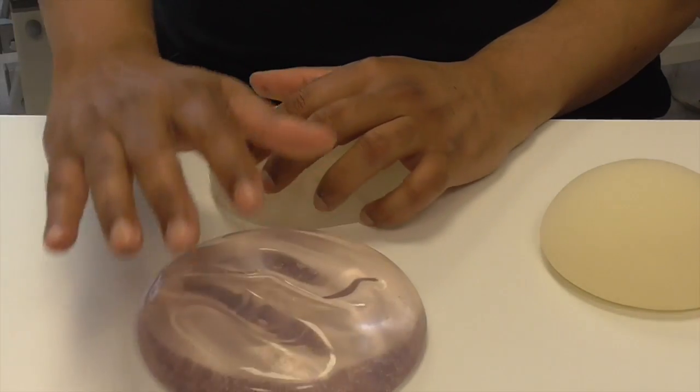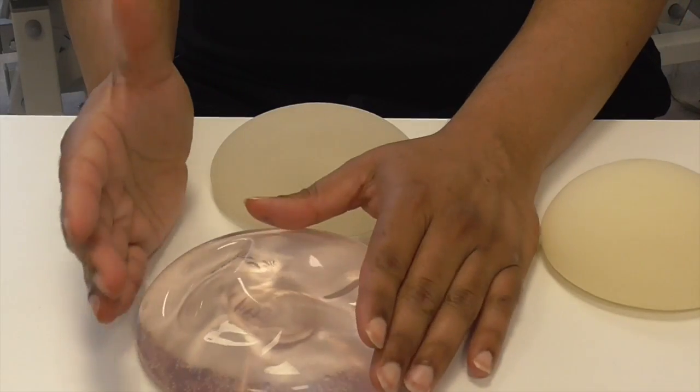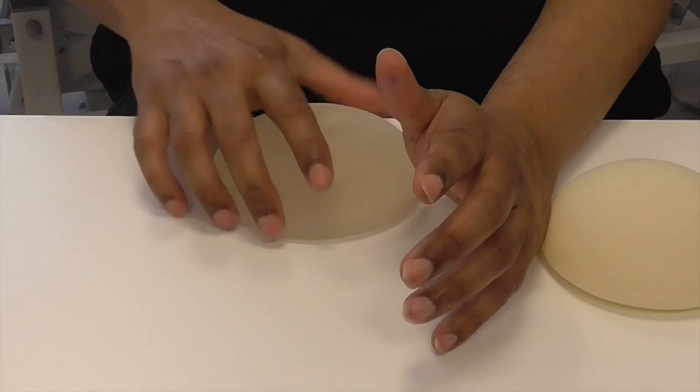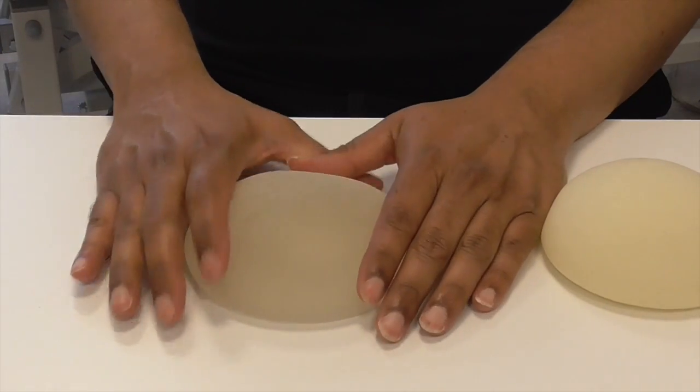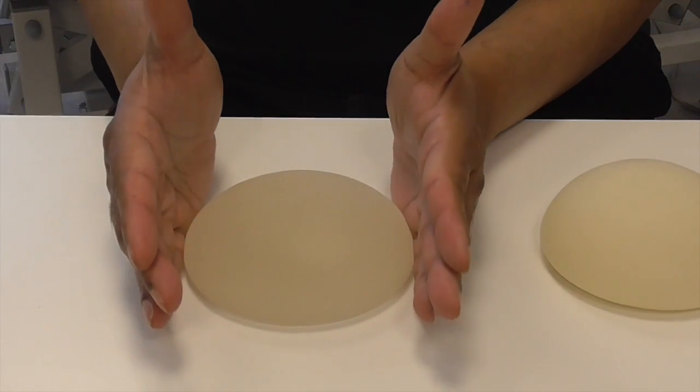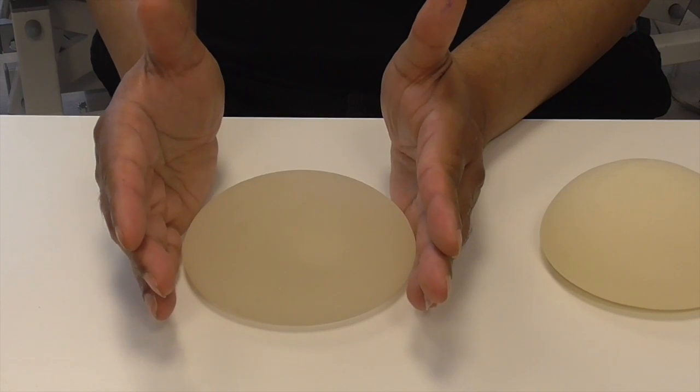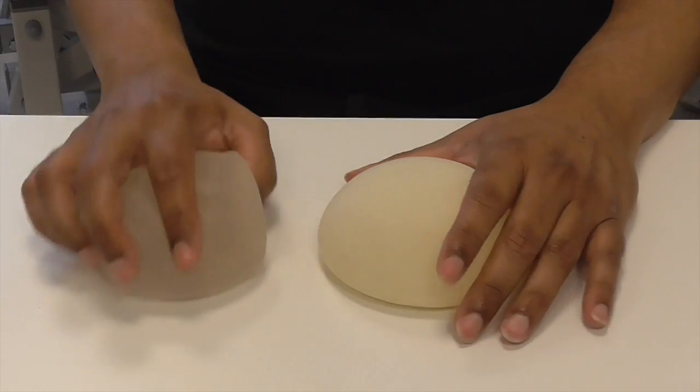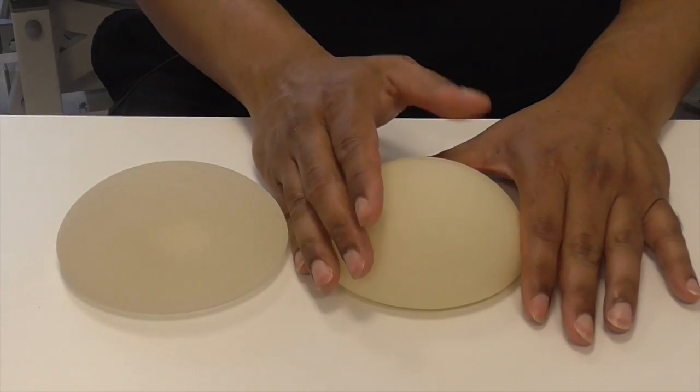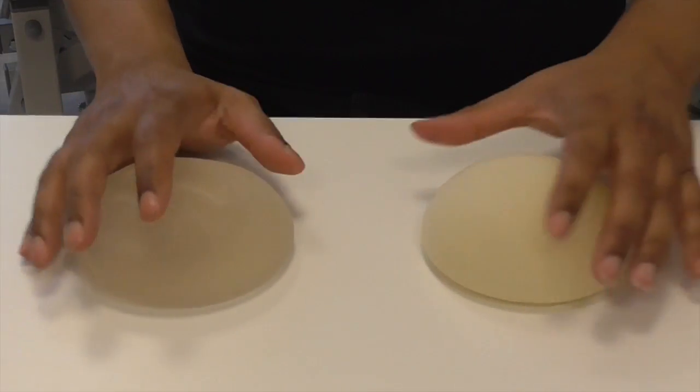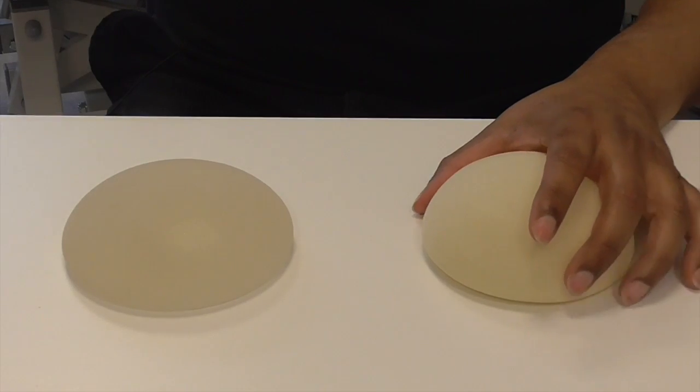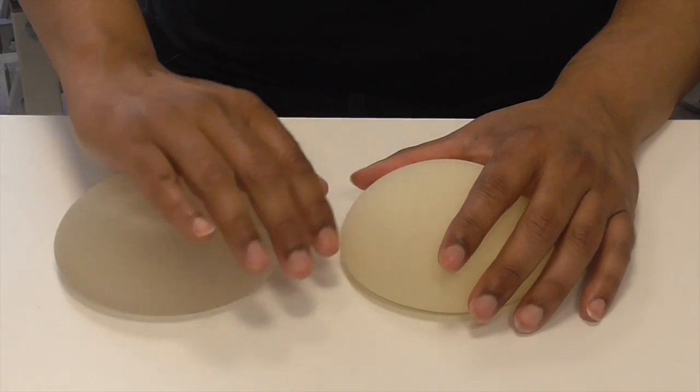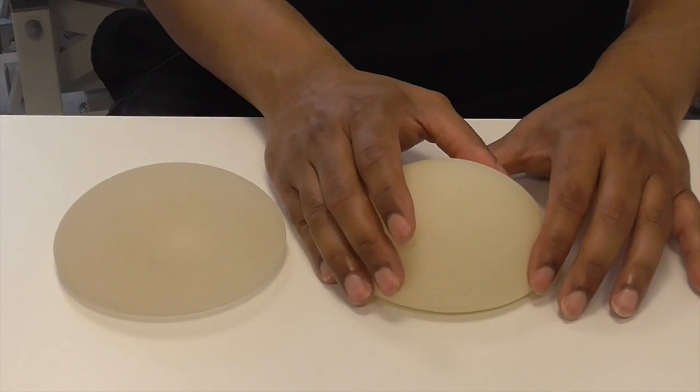With the smooth implant, the incidence of capsular contracture is in the vicinity of 40 percent, so we don't use those for cosmetic purposes in this country. With the texture, the risk has gone down to between 5 to 8 percent, and with the polyurethane possibly somewhat lower. So the vast majority of breast implants for cosmetic purposes are silicone with silicone gel with a texture or a polyurethane coating.